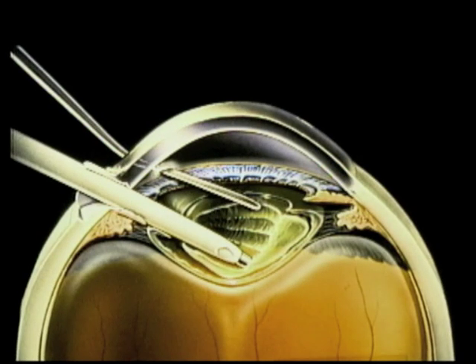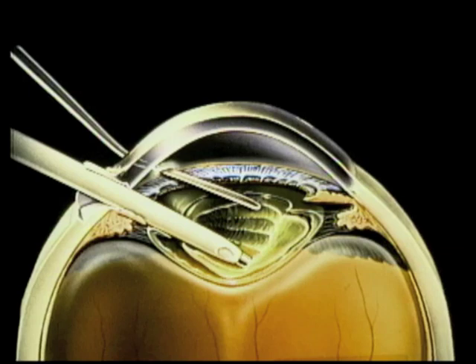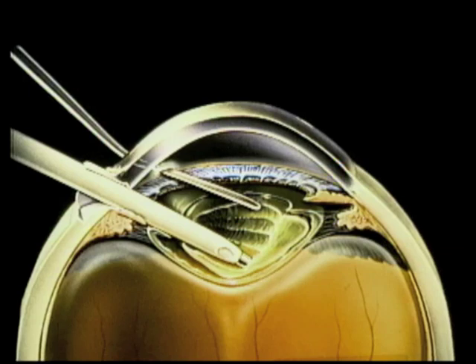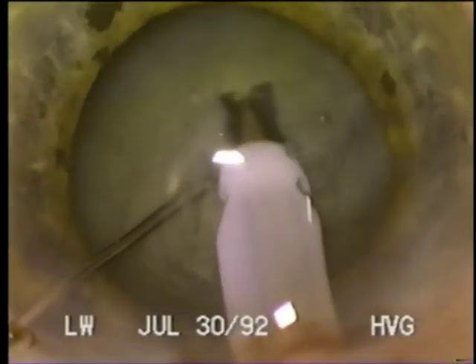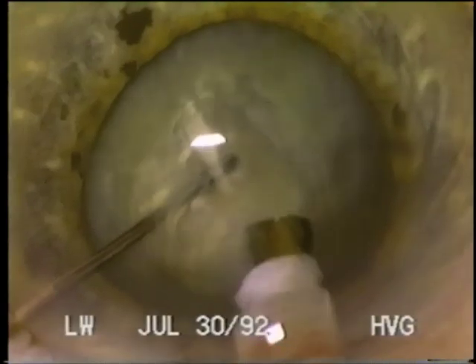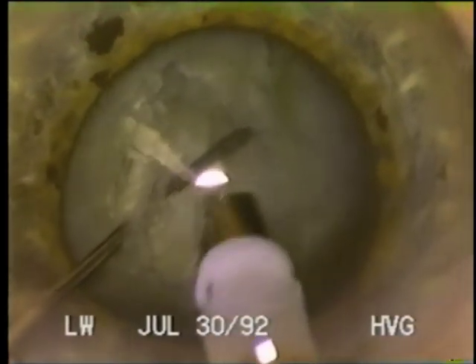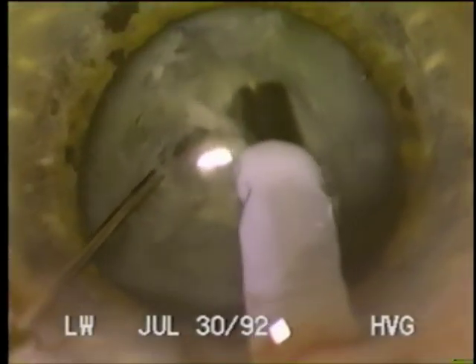With downslope sculpting, when reaching the end of each sculpting pass, there is considerable nuclear material ahead of the tip. Breaking through is therefore unlikely with this cushion present. This case illustrates how the downslope sculpting technique lends itself to dense, mature lenses. No pre-grooving of this lens will be required for fracturing.